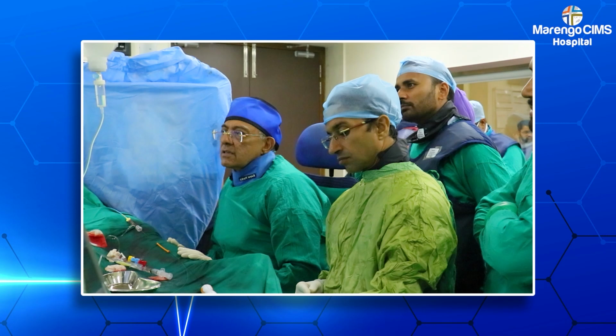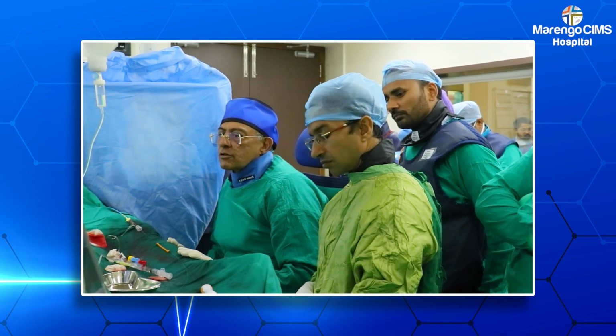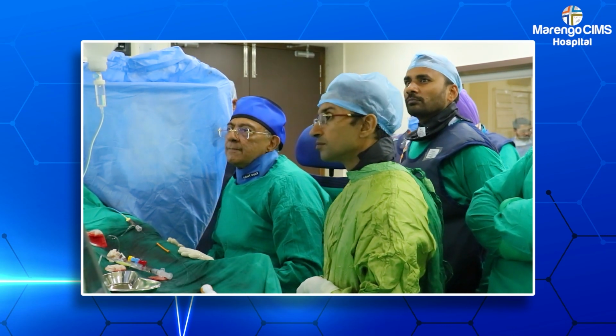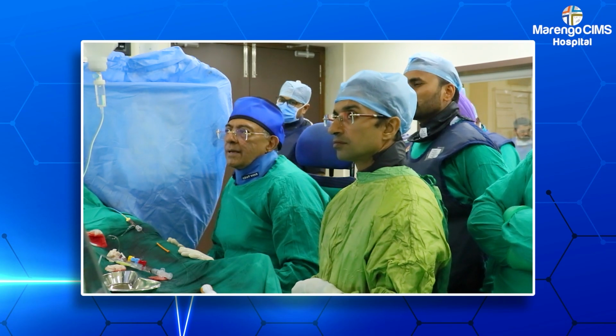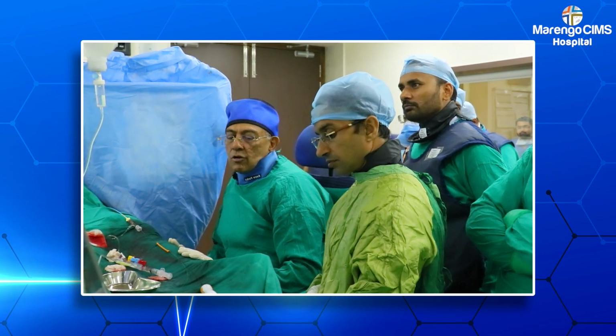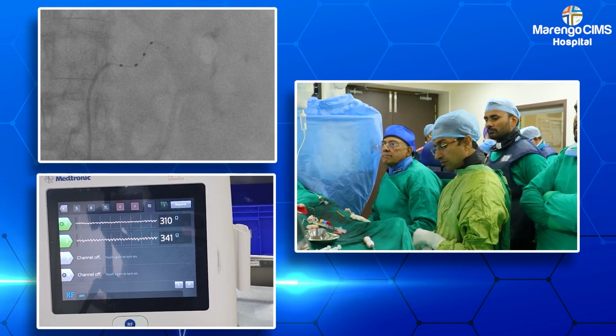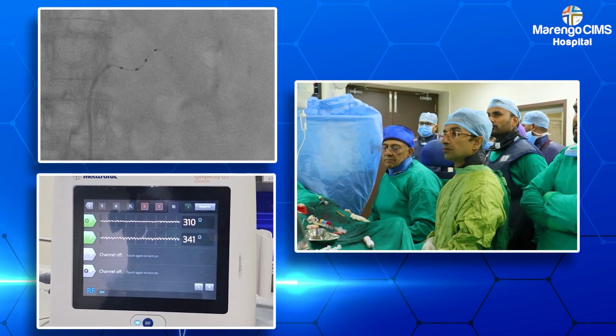With the first and two, otherwise the distal two electrodes are in the right position and not overlapping the carina, so we'll go ahead and ablate them. Good resistance, good contact. Okay. Third and fourth are off. Yes. So we'll start.